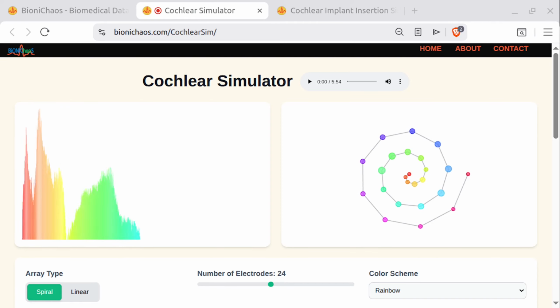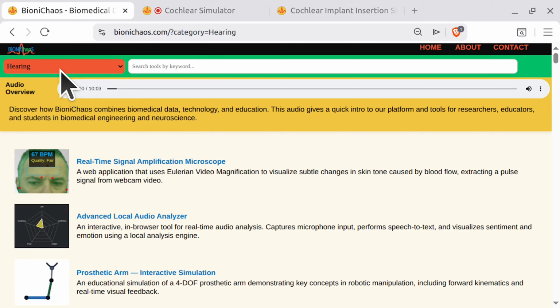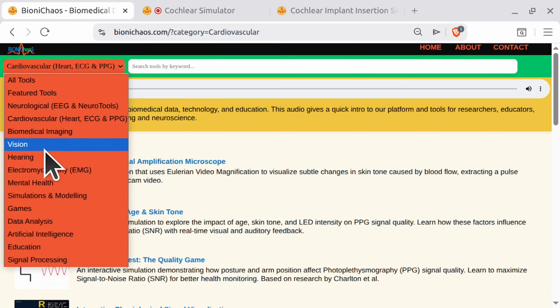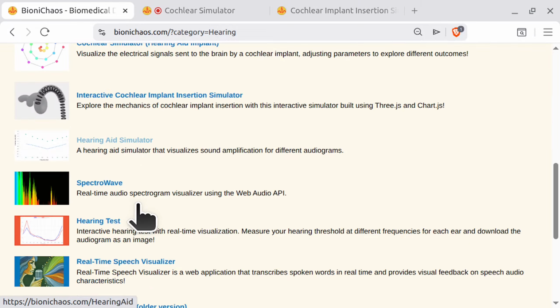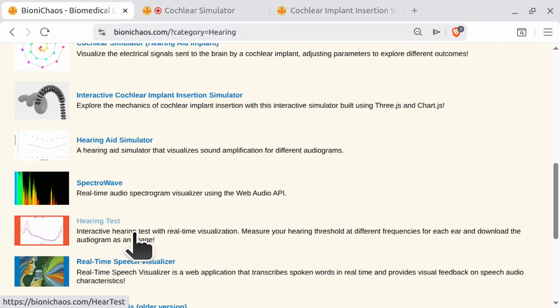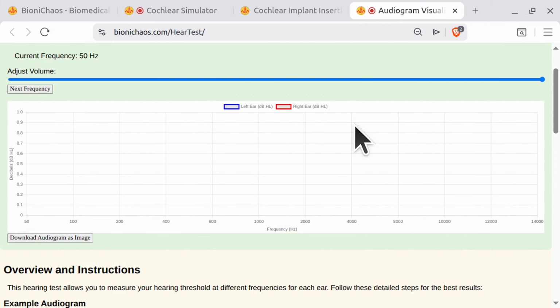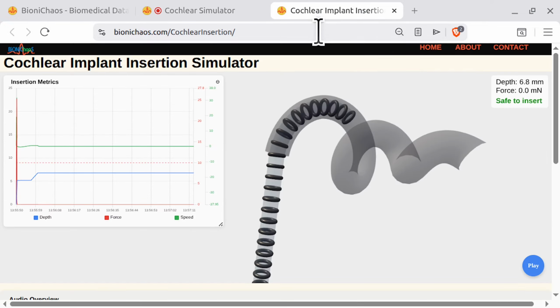But today, the standard is round window insertion. We actually sneak the electrode through the ear's natural, membrane-covered back door. Which is certainly less traumatic than a bone drill, I'll grant you that. It drastically reduces trauma, and we pair that natural entry point with incredibly advanced, flexible electrode arrays. Right. Some of these arrays are 31.5 millimeters long, but they are as thin as a human hair. They're literally designed to curl naturally with the spiral of the cochlea without scraping the walls.